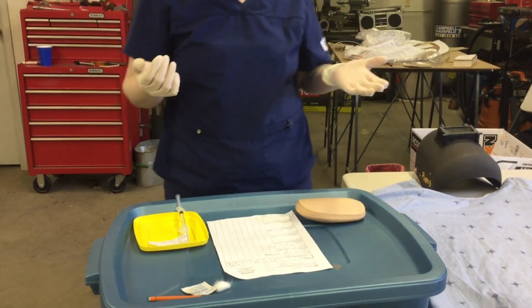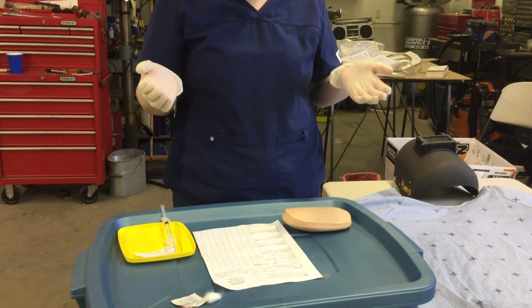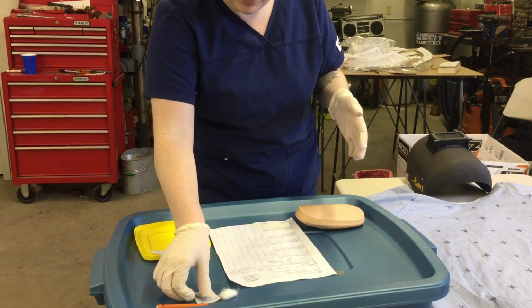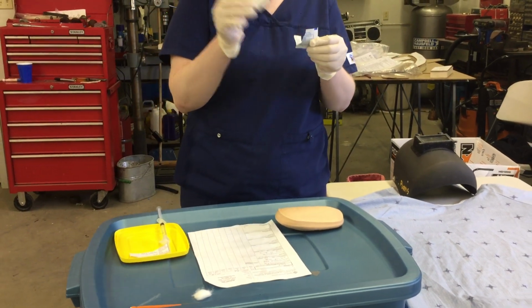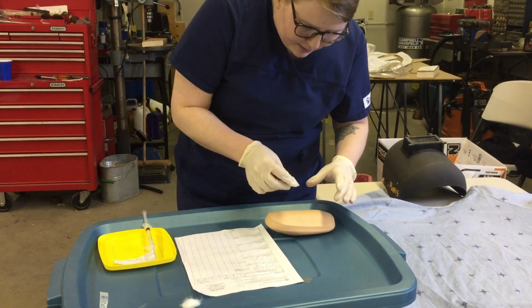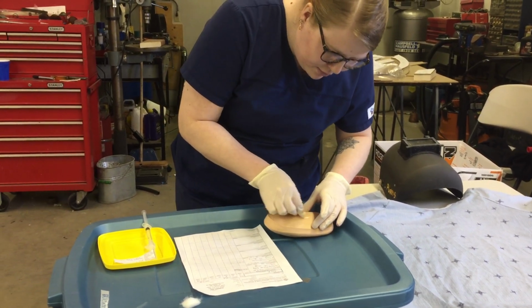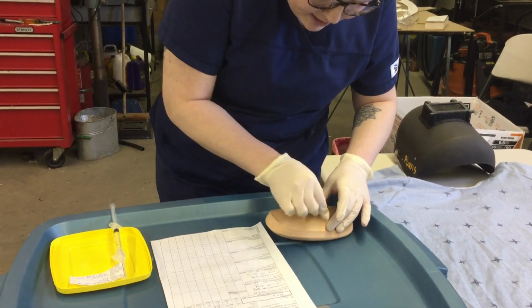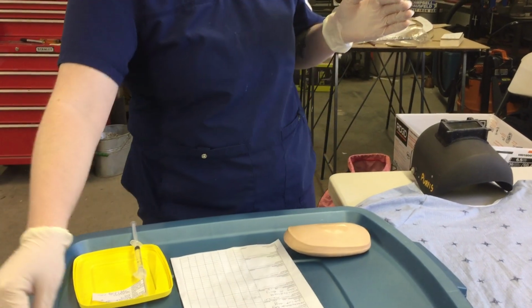Okay, so after I've applied my clean gloves, I'm just going to note that we are going to be giving this injection at a 90-degree angle because it is intramuscular and we're going to be Z-tracking today. So after I've said that, I'm just going to grab my alcohol swab, I'm going to open it, I'm going to discard that in the garbage, and I'm going to be cleaning the site that I just landmarked for 30 seconds in a circular motion. We'll say that's 30 seconds, then I will allow that to dry. I'm going to throw that in the garbage.